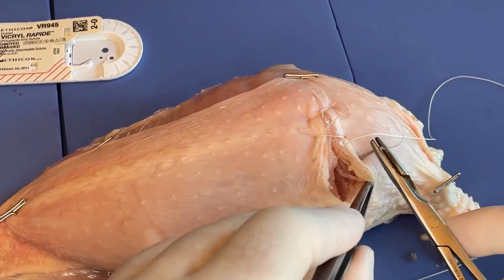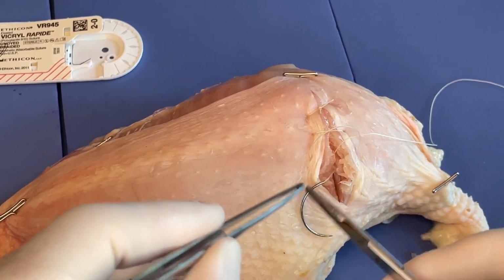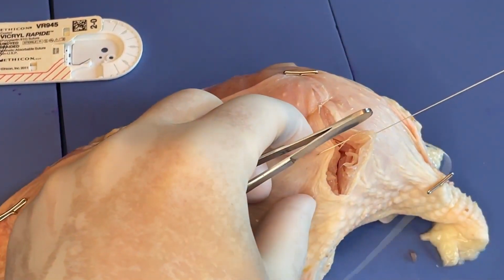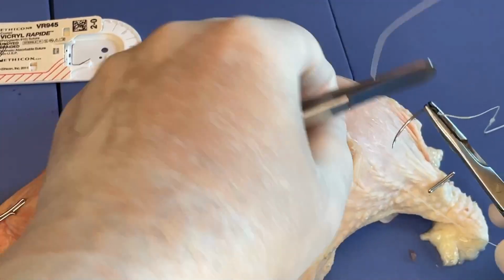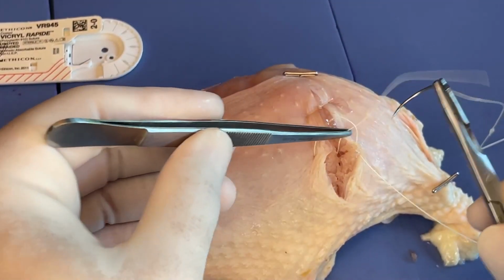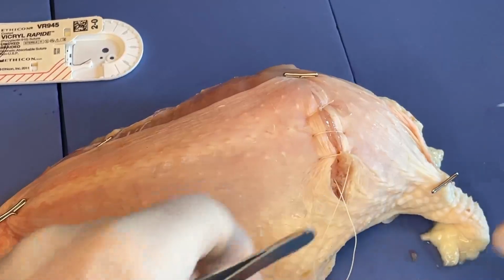And then outside to in. Pull that through. And again, I like to get this free end on this same side just so we don't end up locking that.